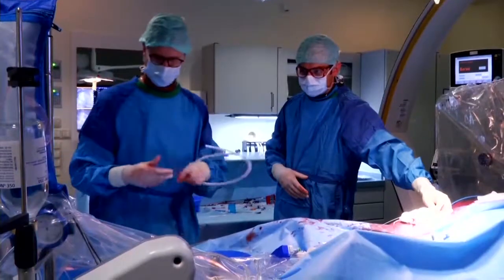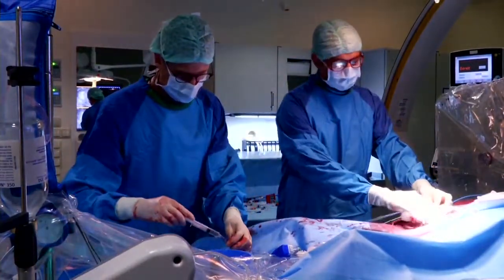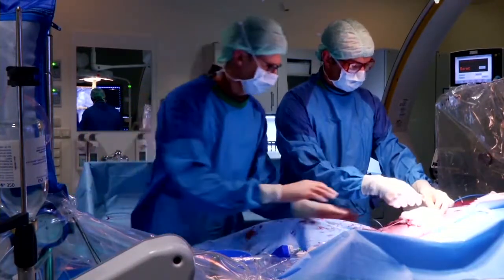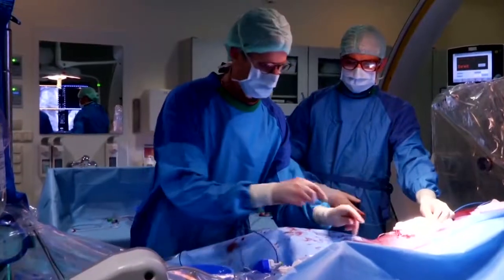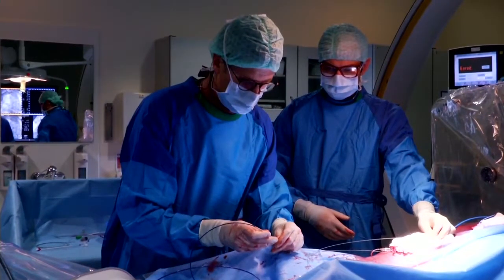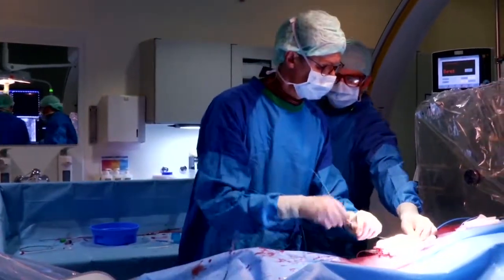Okay. Now we take the Atlas balloon. Does anybody feel comfortable with this 2 centimeter balloon?